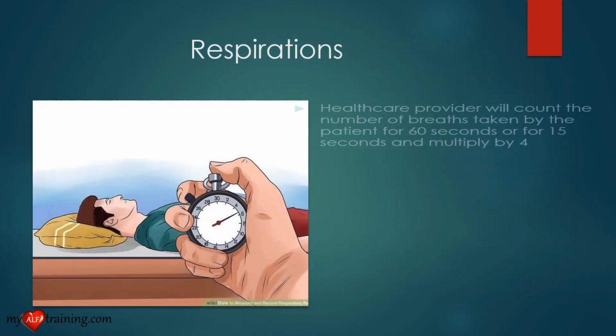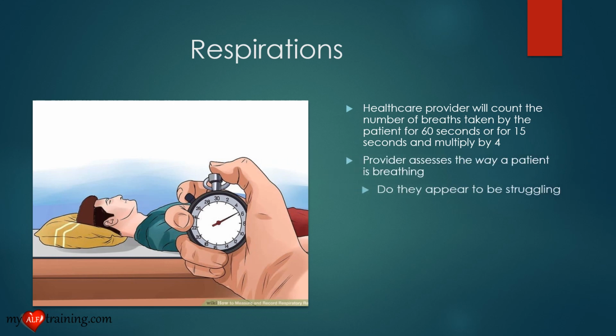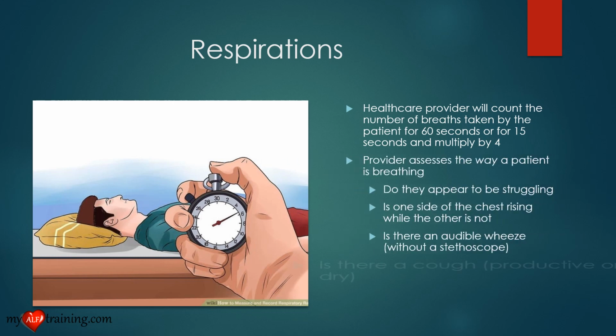To assess respirations, the healthcare provider will count the number of breaths taken by the patient for 60 seconds, or for 15 seconds and multiply by 4. The provider will simply observe the patient breathing. During their assessment, they are also noting if the patient appears to be struggling. Is one side of the chest rising while the other is not? Is there an audible wheeze without a stethoscope? And is there a cough, and whether it is productive or dry?